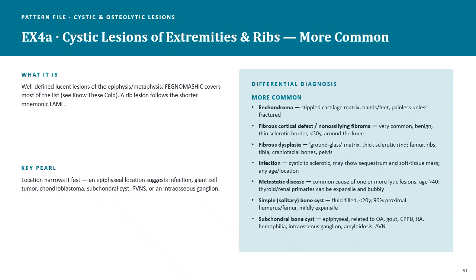So when we're talking about cystic lesions, if we're looking at these on the x-ray, we'll see areas in the bone that look dark or they'll look hollow. In terms of a cystic lesion, again, it's a spot where the normal solid bone has been, I'll say, replaced by something else less dense.